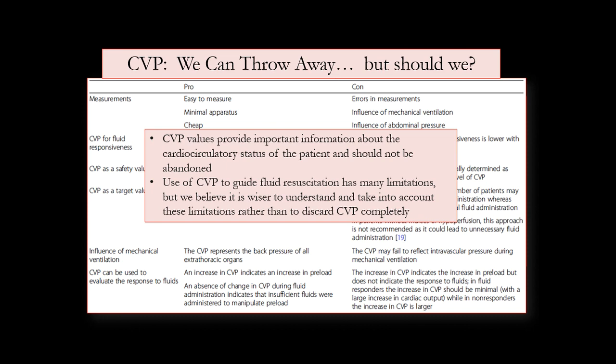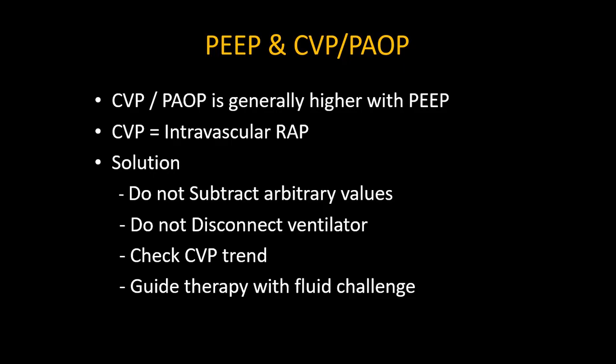CVP value provides important information about the cardiocirculatory status of the patient and should not be abandoned. Use of CVP to guide fluid resuscitation has many limitations, but we believe it is wiser to understand and take into account these limitations rather than to discard CVP completely.